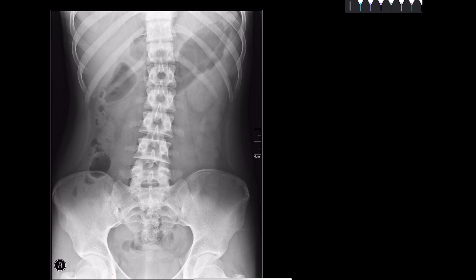After that, we should look at the GI tract and the bowel gas pattern, which can be seen easily. Then we should assess the presence of solid organs. This is a plain x-ray abdomen, so it cannot show all the details, but it gives a rough idea. We should also look for the aorta and any visible vessels, and finally examine the muscles and bones.